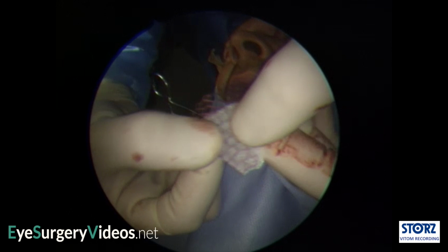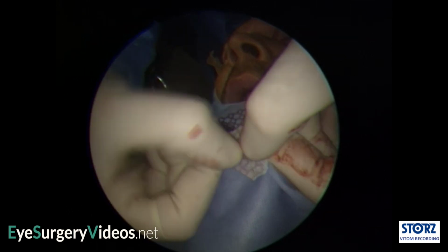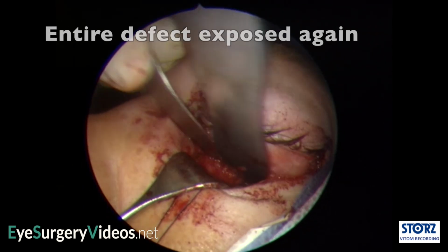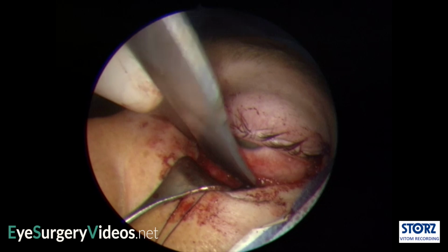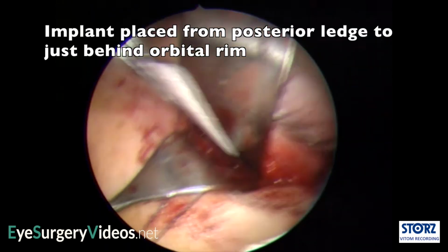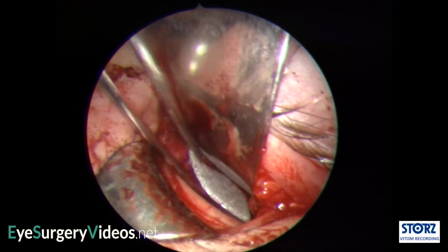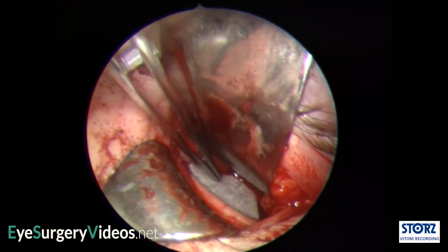This one is a porous polyethylene-covered titanium implant. This has some of the advantages of both substances in providing the pliability of titanium, but with the smooth surfaces of porous polyethylene to lessen the risk of adherence of orbital tissues and avoid the sharp edges of titanium when the implant is cut. It also has screw holes, although these are not being used in this case as the implant will be firmly held in position by the globe.